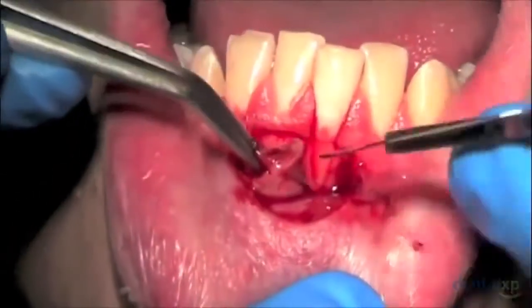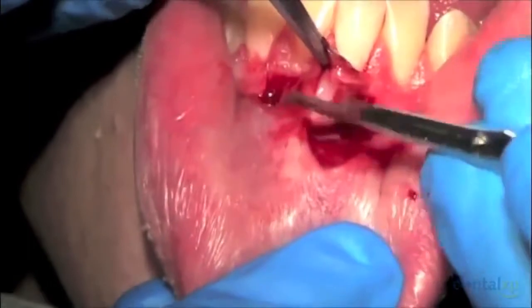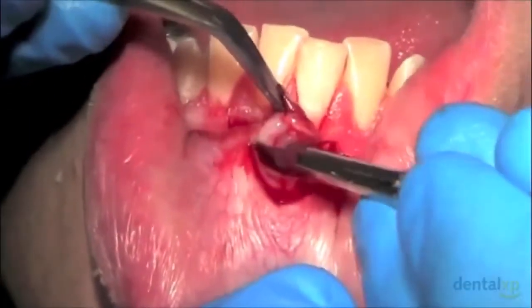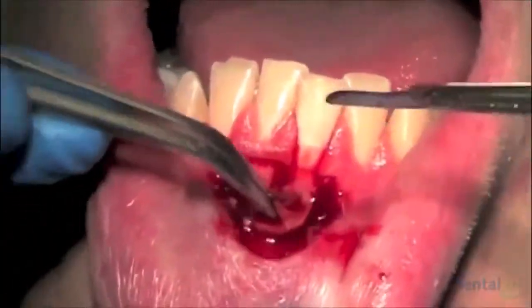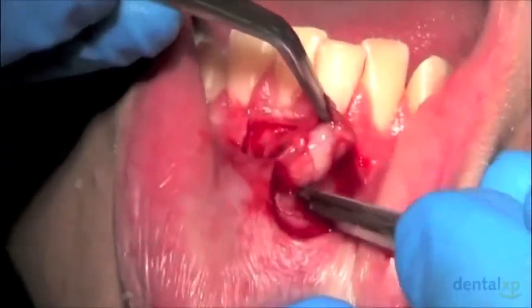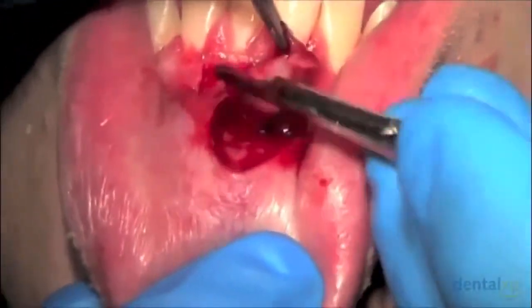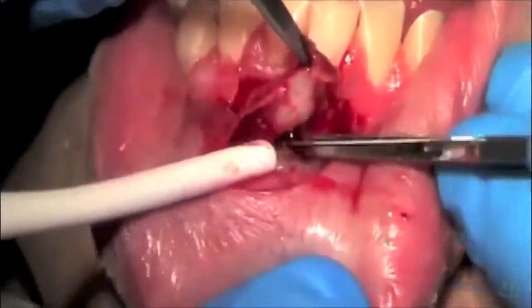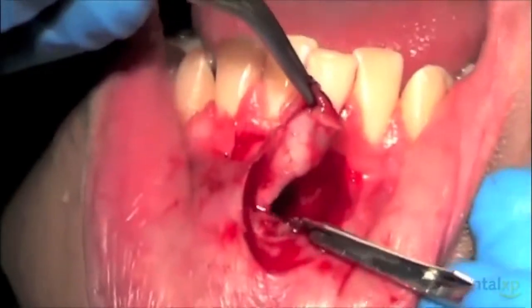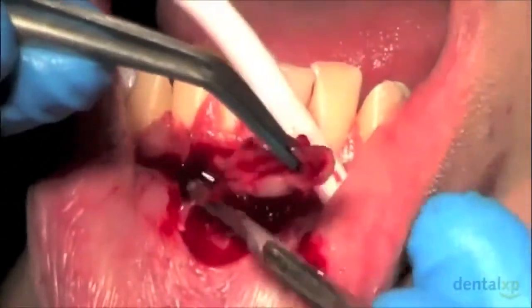My next step here is to switch to a fresh number 15 blade, and we're simply removing that overlying flap of tissue, which is once again very loose, unattached, unkeratinized, overall not very resilient tissue. So once this piece of tissue is removed, we will then transplant the free gingival graft that we took from the palate over this freshly prepared recipient bed.